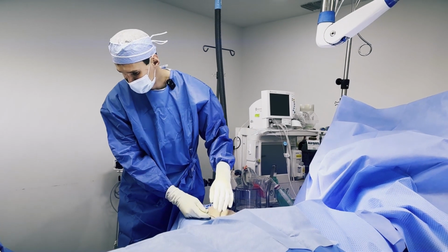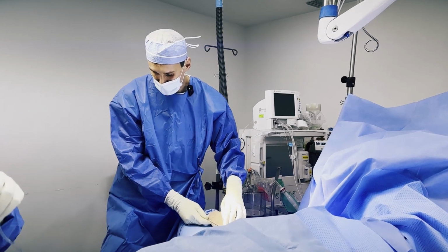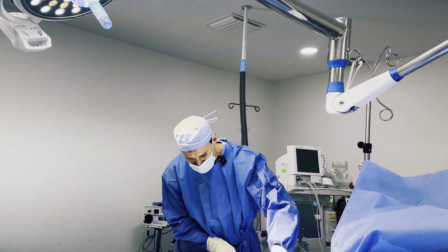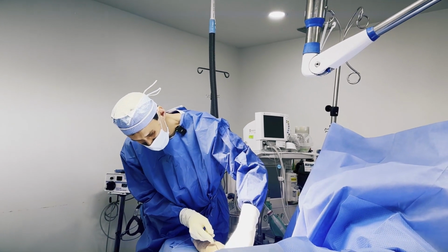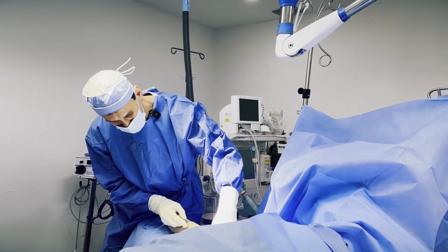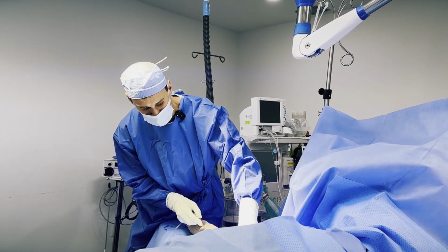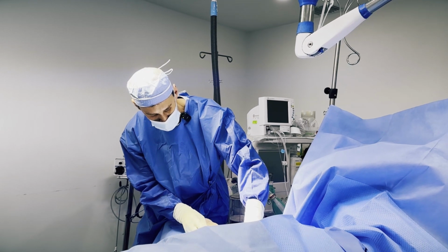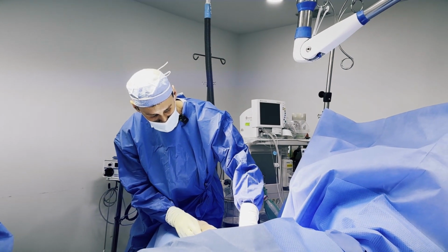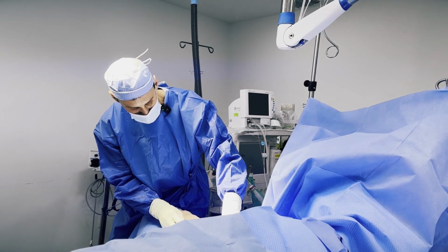Okay, little gauze and the pedal. Okay, Mary, here's the fluid that's coming in, okay? So it's Pronox nitrous, a half and half mixture of laughing gas with oxygen. The patient can self-regulate and take as much as he or she wants to. And she's very comfortable, she doesn't feel much. Maybe a little pressure, a little burning sensation. I'm okay now.